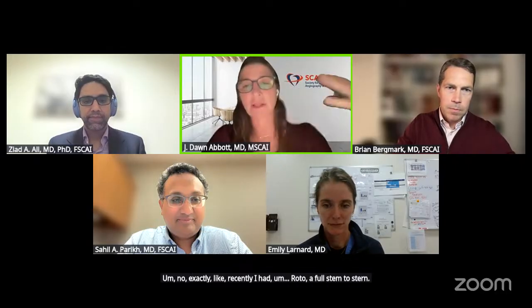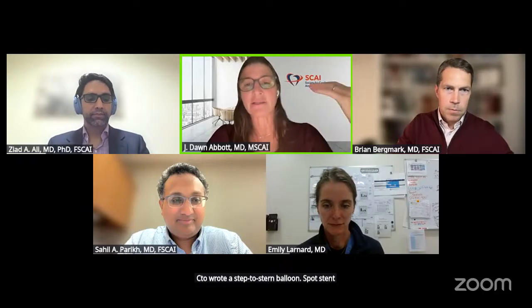Other thoughts, any of our panelists? No, I think the diffuse lesions are exactly where the benefit will be. And then, if it's focal restenosis, you can use some other therapy. No, exactly. Recently I had roto, full stem to stern, CTO, roto stem to stern, balloon, spot stent, critical areas, and DCB the mid to distal third of the vessel with 2 long DCBs.